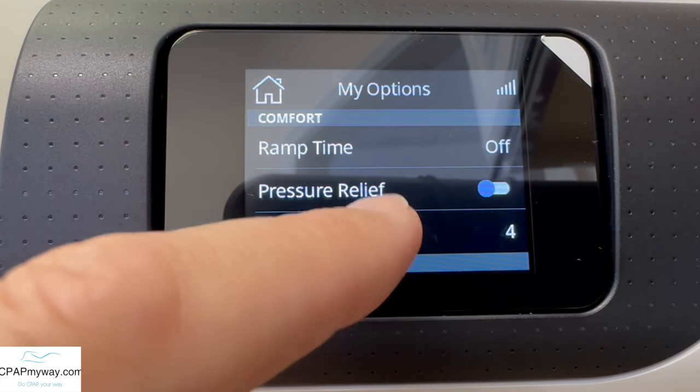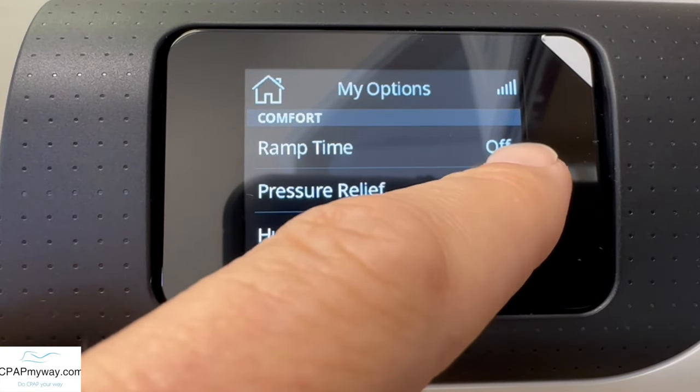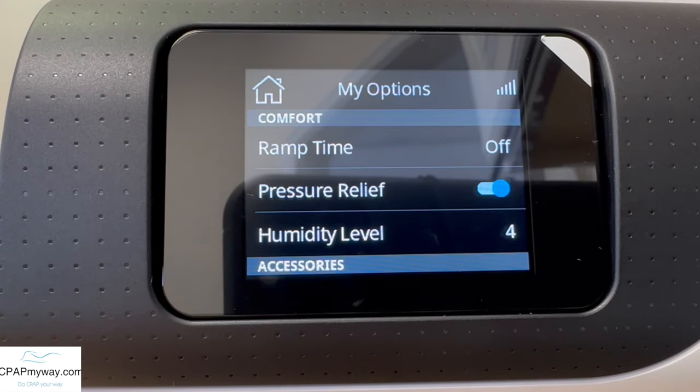For some old school users, they like it off. For new users, the exhalation relief is a nice setting.